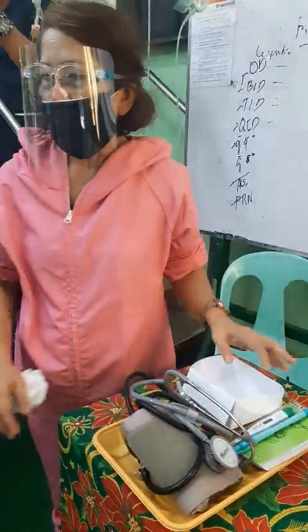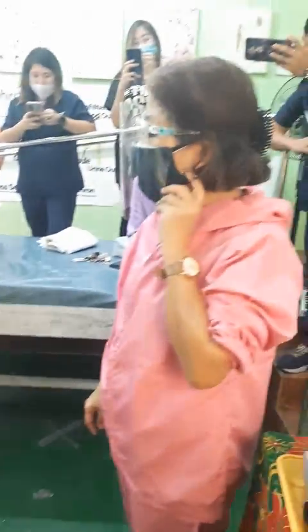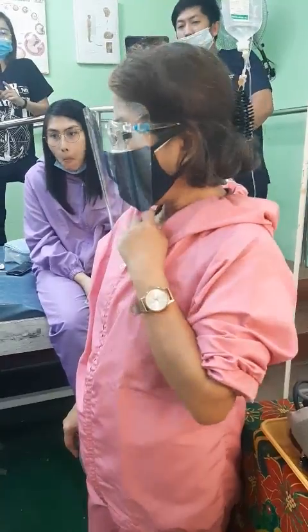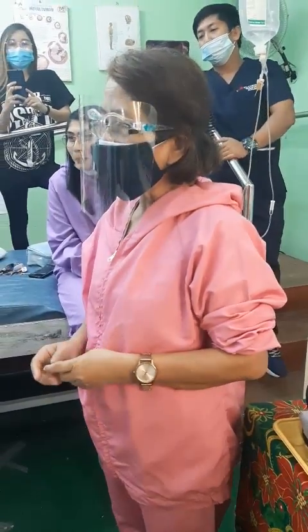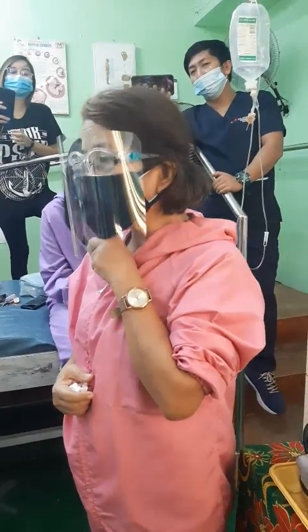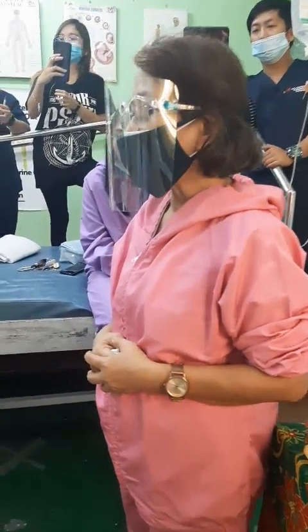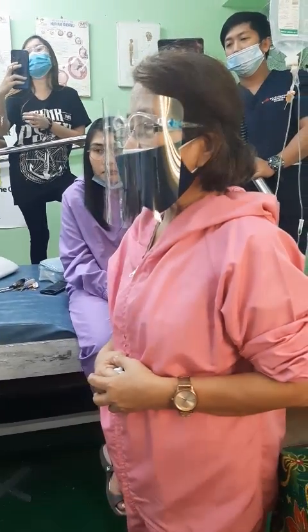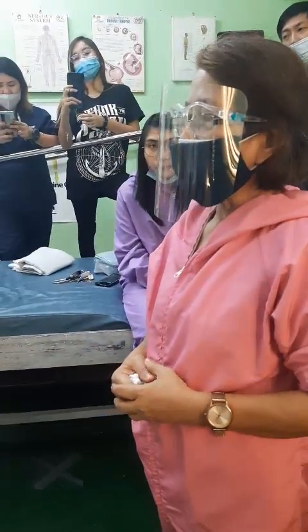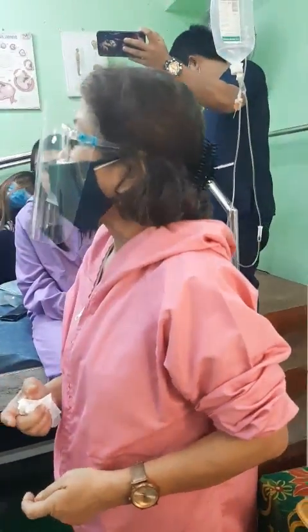Now that I have tested this and it is functional, I will approach my patient. Good morning, Ms. Grace. I am a caregiver from 7 to 7 p.m., Monday through Friday. I will take your vital signs and your temperature after 5 minutes only. If you have taken coffee or any hot drinks, that will alter the reading of your vital signs. Am I clear? Yes.